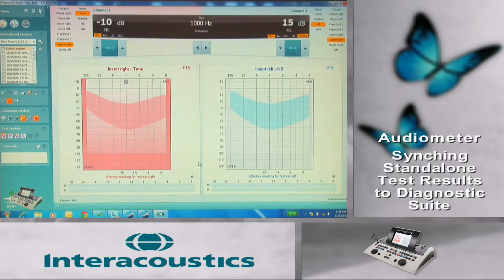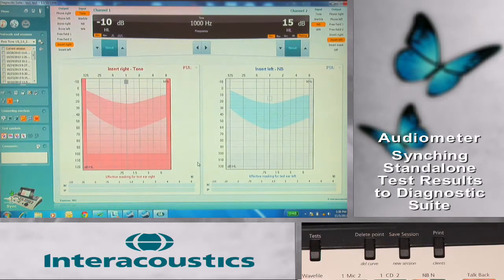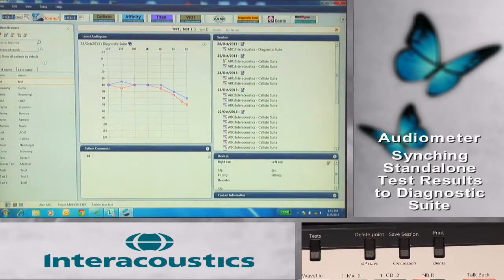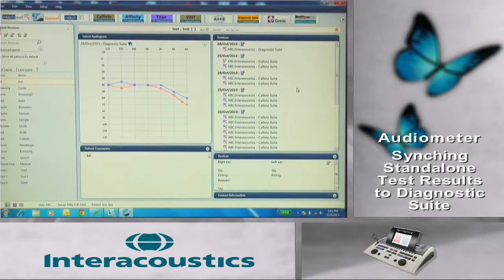For syncing of results, the quickest and easiest way is by pressing the Save Session button at the completion of the test. The results transfer to the PC within a few seconds and can be saved and stored within the software.